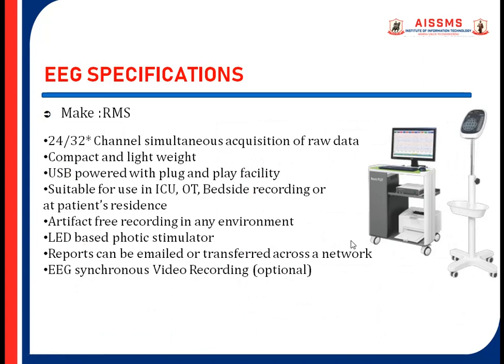EEG specification. These are the RMS make EEG specifications.